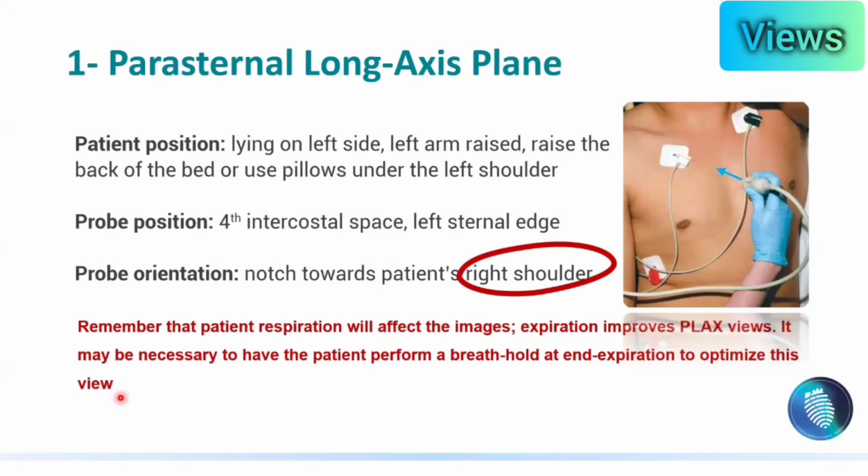For example, if I told you, excuse me, Dr. Amira, hold your breath, what will you do? You will do like this. So you took a deep breath and you stopped your breathing. This will get us a very bad image, because the patient holds his breath in deep inspiration, and holding breath in inspiration makes the lung fill with more air, and this more air filling will make more attenuation to ultrasound beams, because the air has very bad acoustic properties and most of the waves will be refracted and attenuated.